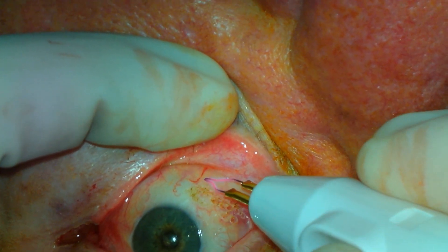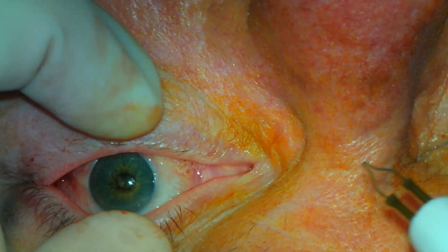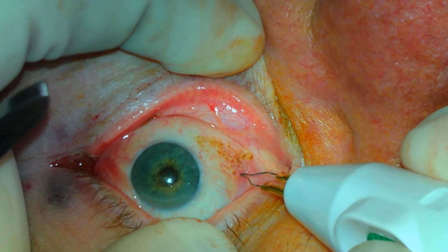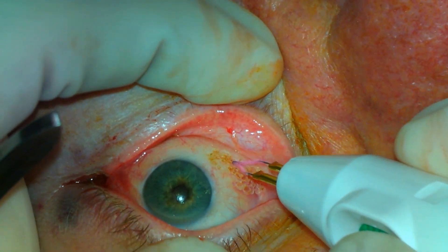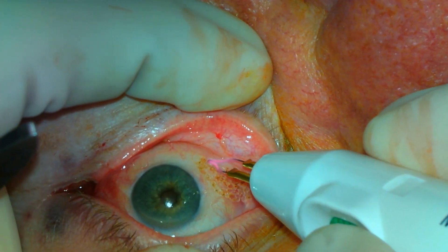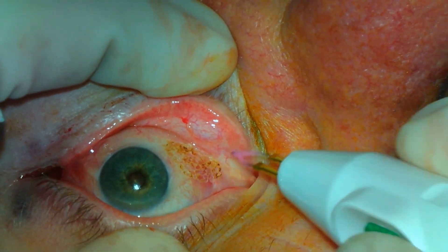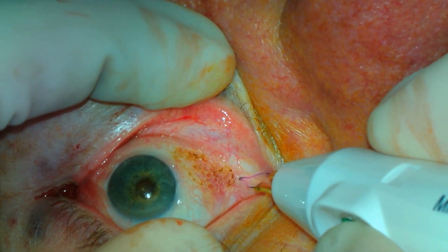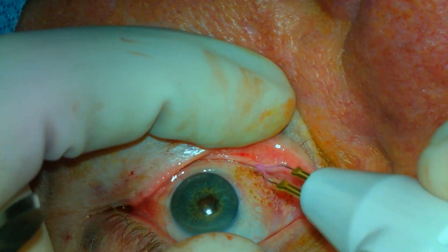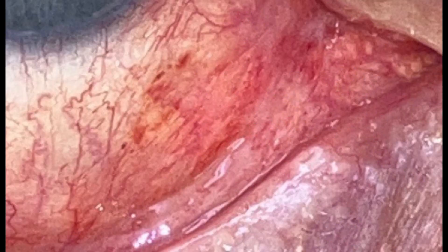The patient will apply antibiotic ointment to the area three times per day for a week. They will follow up in approximately two weeks for re-evaluation. The two photos at the end of the video show the areas two weeks after surgery. In general, patients will have some irritation after the surgery, but this is usually addressed well with the antibiotic ointment.